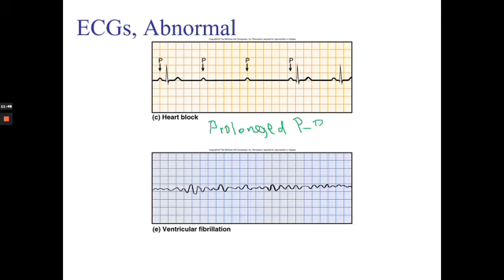PR interval. So this interval will be more than 0.2 seconds. This is the interval. So these are the P's here. So the PR interval is very prolonged. This is, as you see, this is a saw-shaped tracing, like the teeth of a saw.